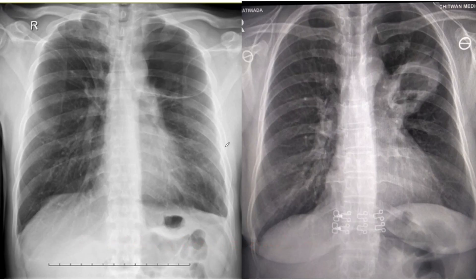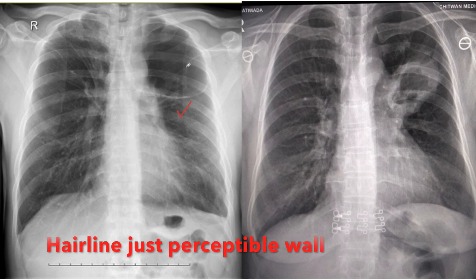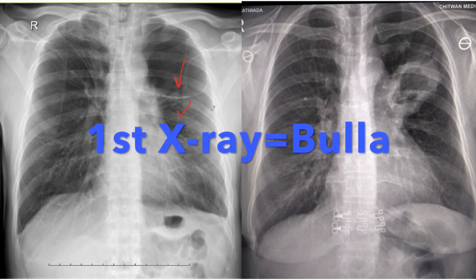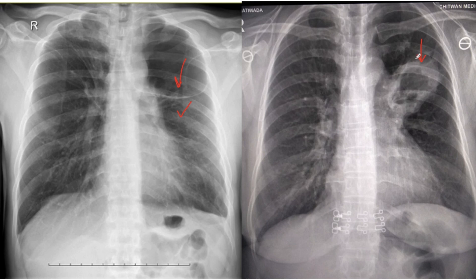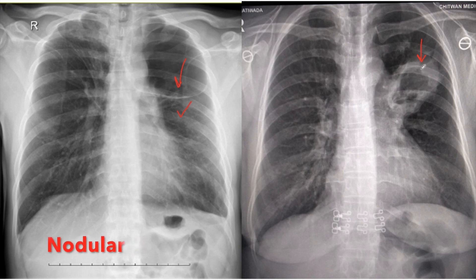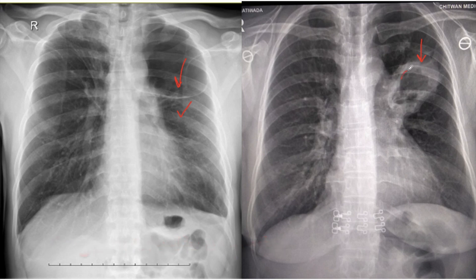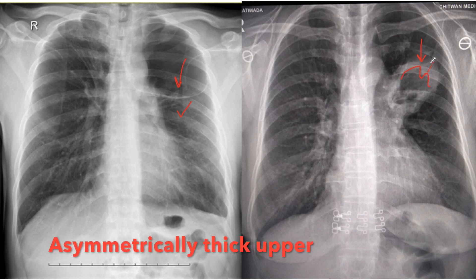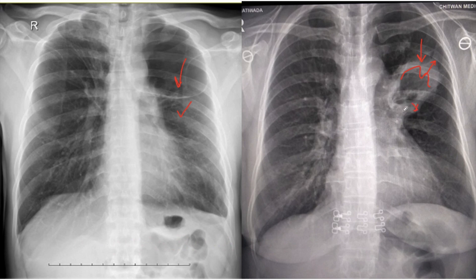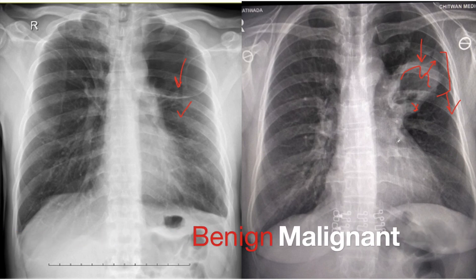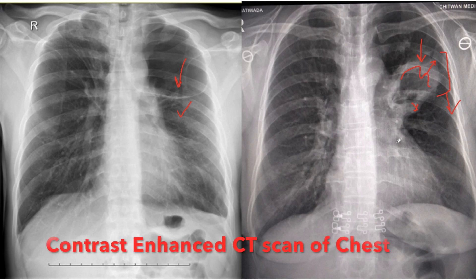Finally, coming to our query. In the first X-ray, we can see that the lucency in the left upper zone has a hairline, just-perceptible wall — hence, it is a left upper lobe bulla. In the second X-ray, the lucency in the left upper and middle zone has a definite wall. This is a cavity, and the wall appears thick, nodular, and asymmetrically irregular on the inner aspect — more thick on the upper region and less thick on the lower aspect. So this feature suggests that this cavity is a malignant cavitary lesion. Sometimes on an X-ray we may be confused in differentiating benign from malignant cavitary lesions, and that problem can be resolved by a contrast CT scan.